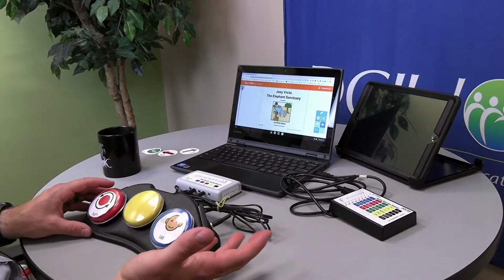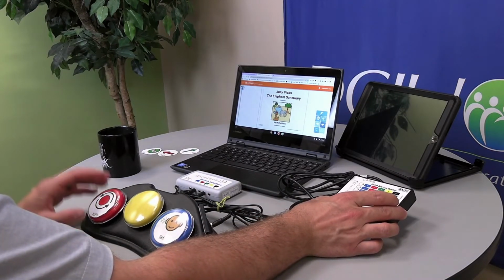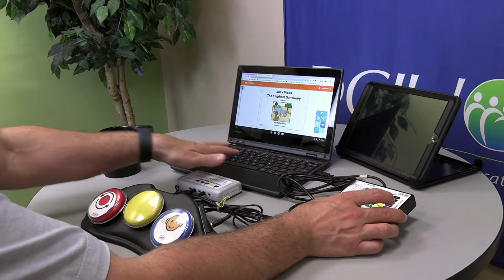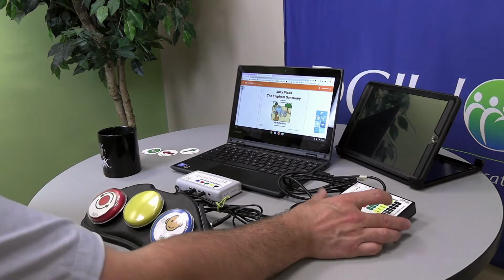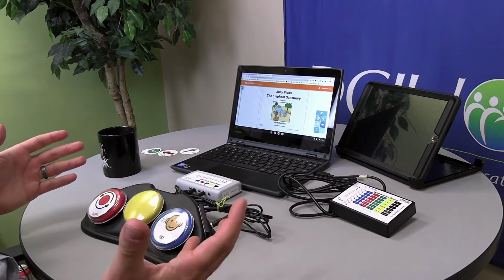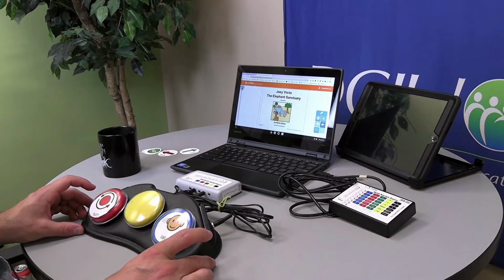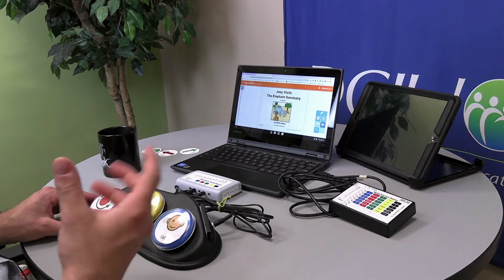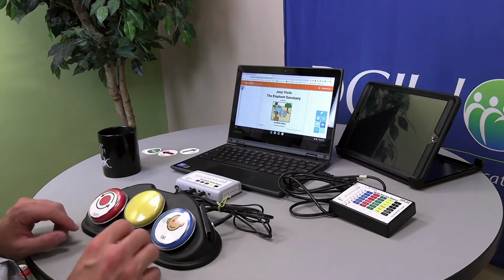All right, for the next activity, we've actually changed up our button overlay because the website that we are now utilizing requires different keyboard inputs, so we have to reflect that with our Switch layout. We also have an opportunity now to practice some different core vocabulary words. So we moved from back and next to now turn to turn the page, and listen to be able to activate and listen to the text-to-speech feature of the website. So let's go ahead and try it.